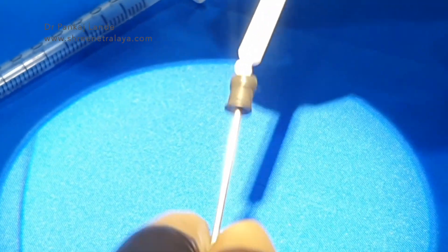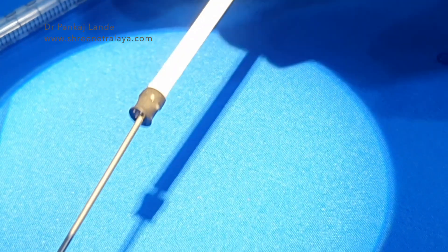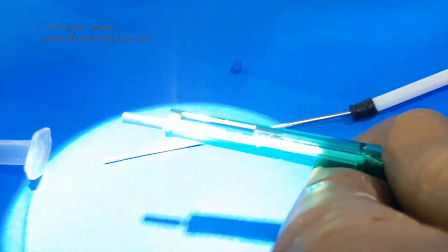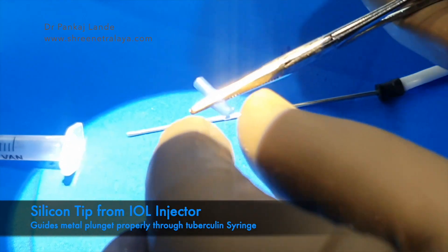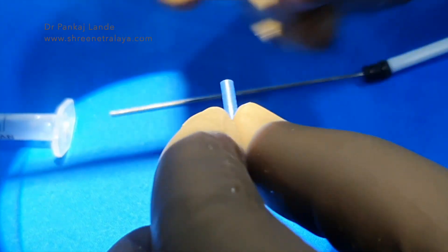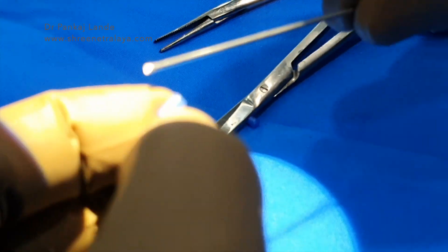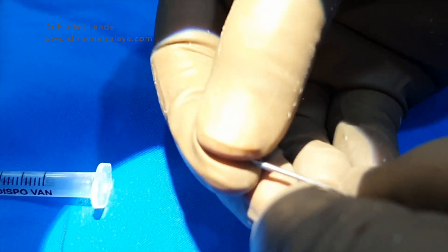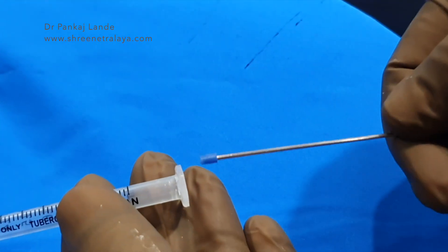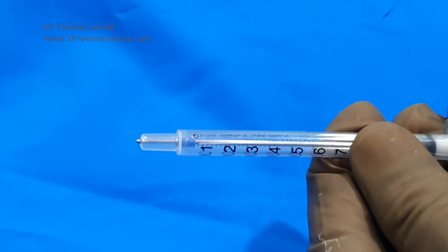This will be our inserter for CTR. If you insert this metal rod into the 1ml syringe, it will go to the sides and will not come out easily through the center. To overcome that problem, I have taken a silicone tip from an IOL injector and inserted it into the tip of this metal inserter. This silicone tip can be taken from any disposable IOL injector. With this silicone tip attachment, we will insert this into the 1ml syringe and the metal inserter will come out of the 1ml syringe very easily.